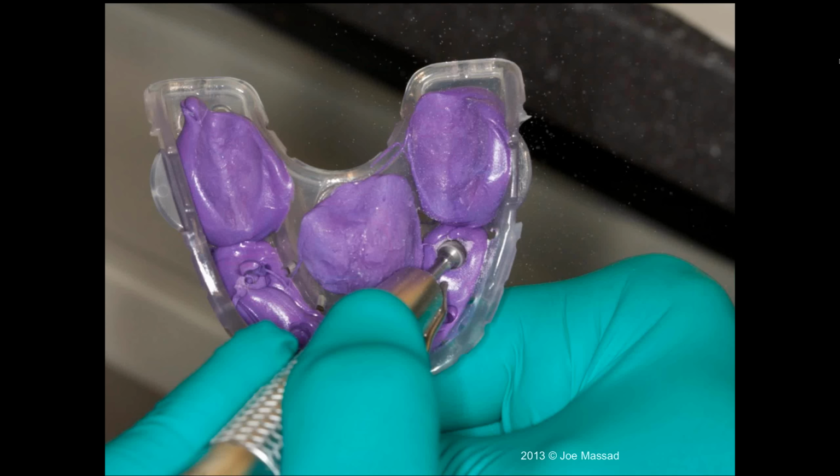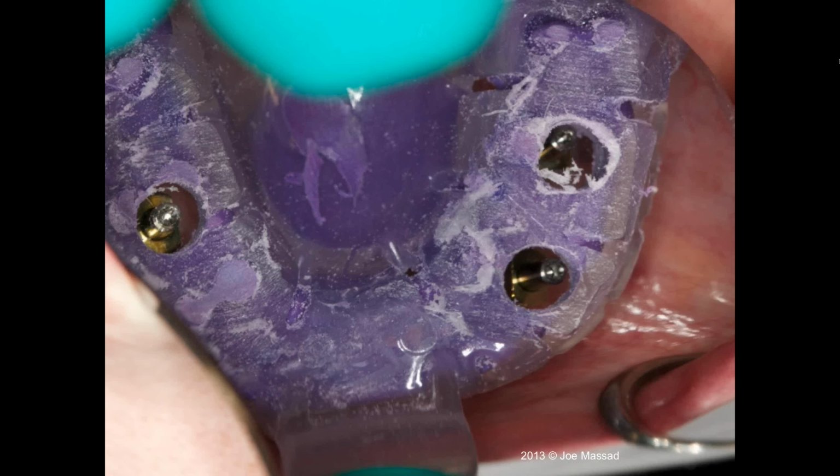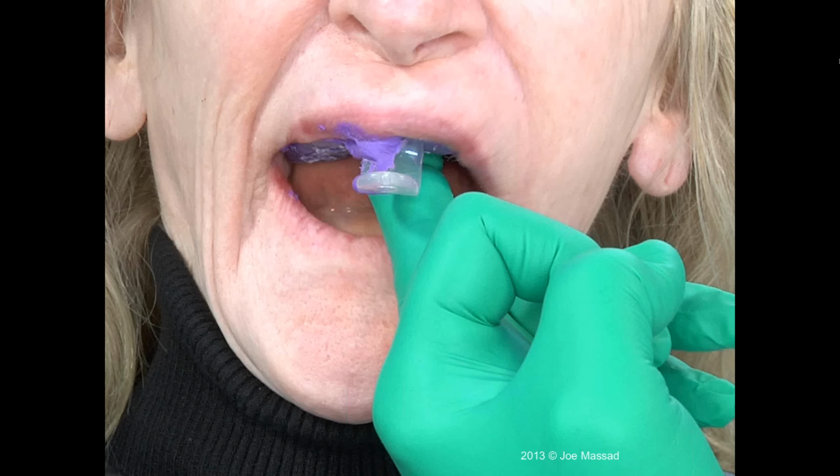The rationale behind this is if it's going to be an overdenture and I need to respect the peripheral anatomy, then I need a functional impression around the peripheral borders. Therefore, I will go in, have the patient go through patient movements, not necessarily doctor-directed, but patient-directed movements by sucking outward, smiling, opening wide, breathing in and coughing while we occlude the anatomy.